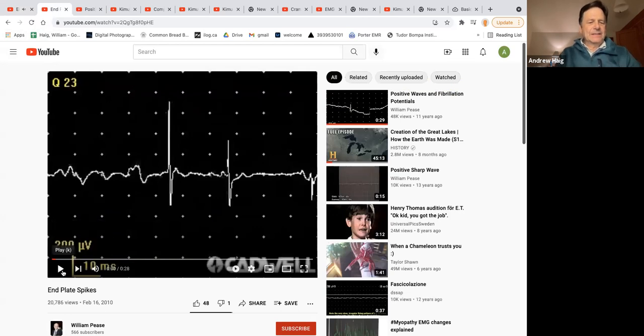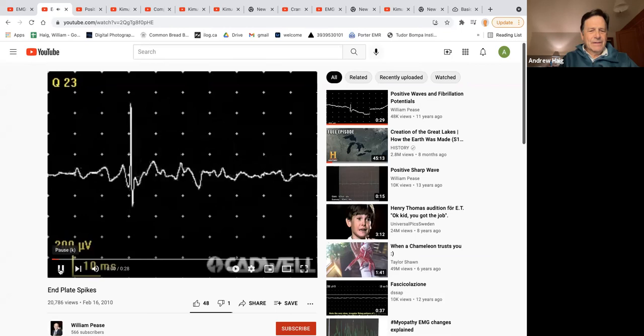These are end plate spikes, and listen to them. There's a motor unit, they look like, right? Anything that goes up first is good. It's not abnormal. If it goes down first, it's a positive wave or fibrillation, and that's abnormal. So take a listen here.